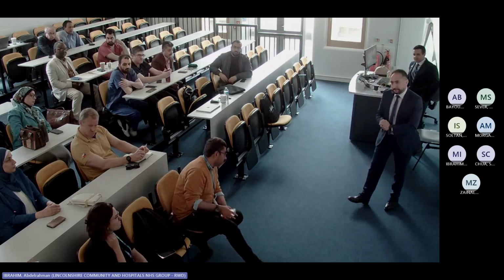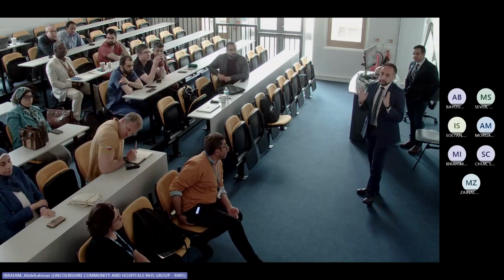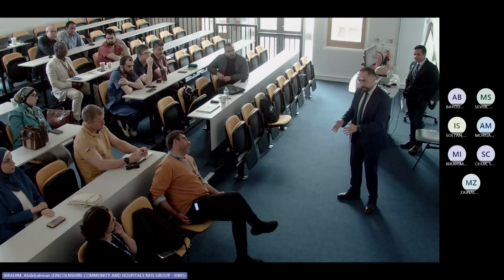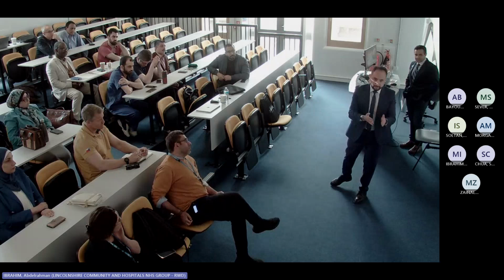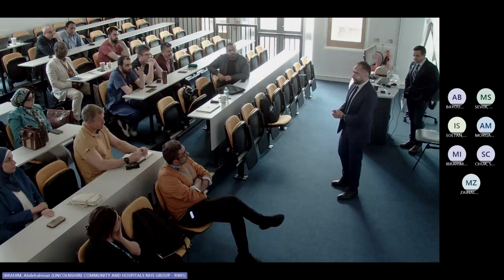The balloon dilatation, does the balloon reach the bony part as well, or only? No, it's mainly on the cartilaginous part. The aim of the balloon is to crush the cartilage. Crushing the cartilage initiates an inflammatory reaction, causes a bit of scarring, causes a bit of dilatation. That's why we measure it after 6 weeks, 6 months, 1 year, and see how much improvement.